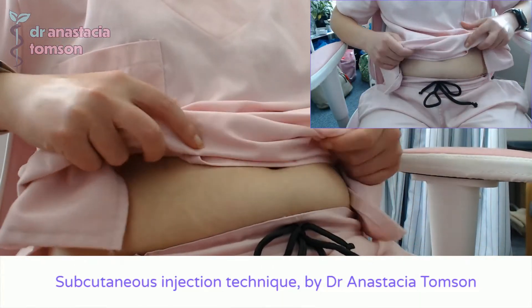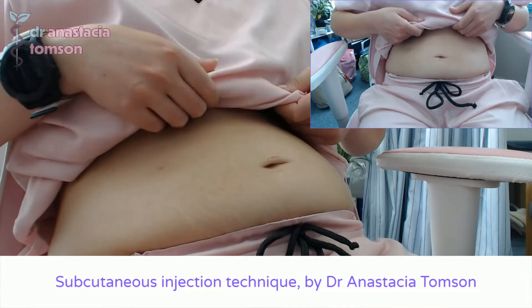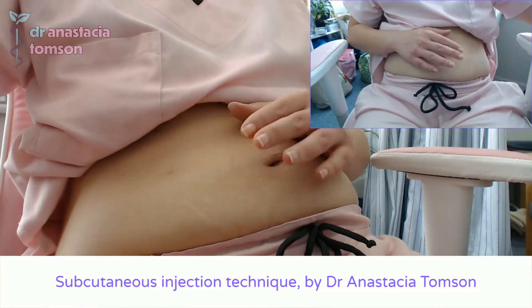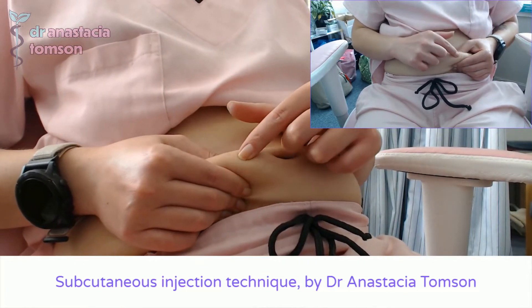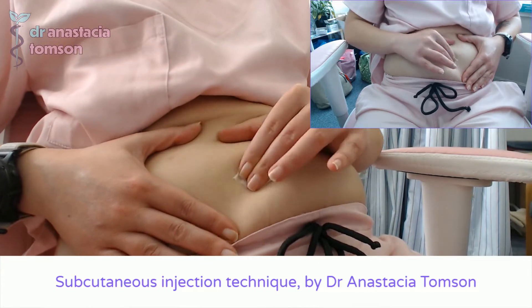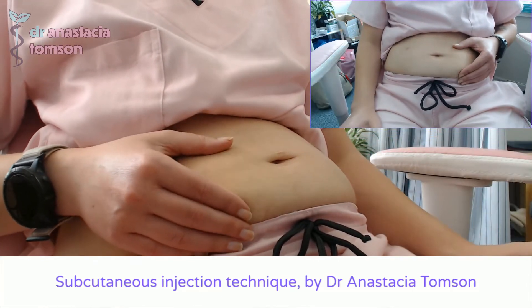The subcutaneous injection is easiest to administer to yourself in a fold of skin on the abdomen. I've rolled my top inwards to prevent it from falling down while I inject. I'll feel around to make sure there are no lumps or bumps from previous injections — those do tend to clear up within a week or two. I've found a nice spot, so I'm going to clean it with the next alcohol pad, going outwards in a circle of increasing diameter to kill any bacteria on the skin surface and push them aside.